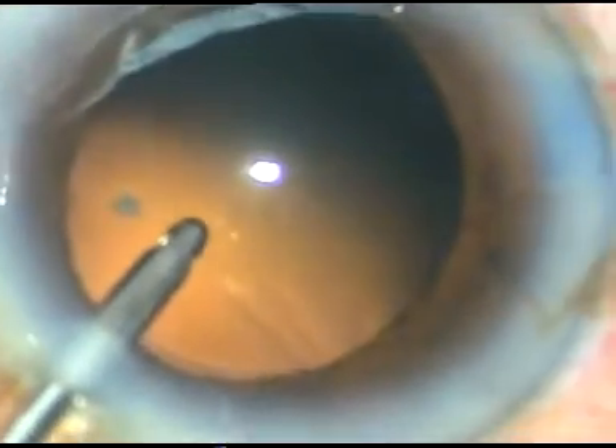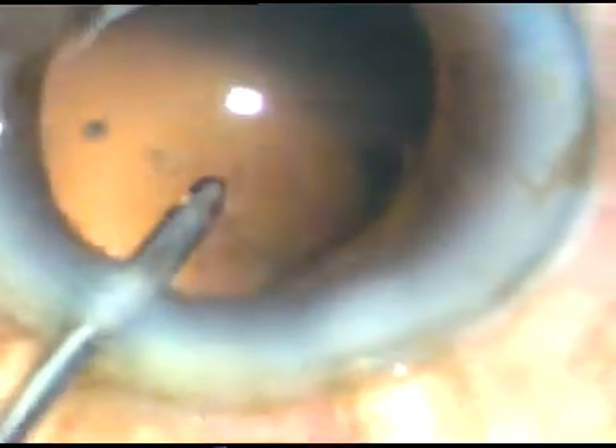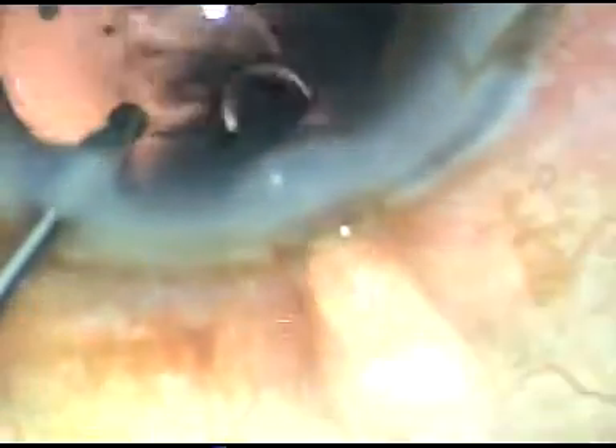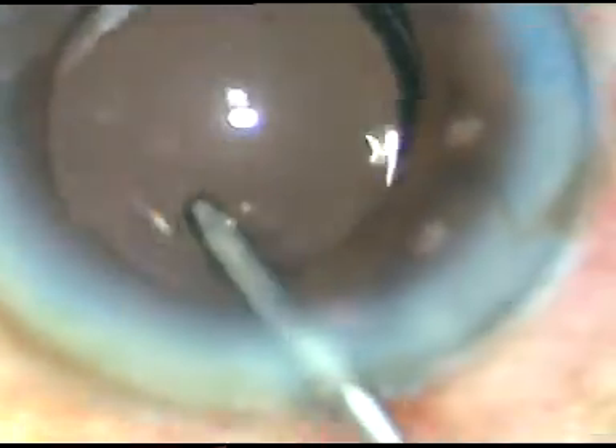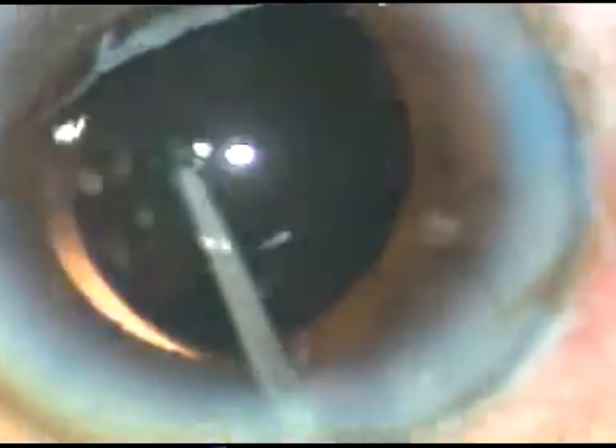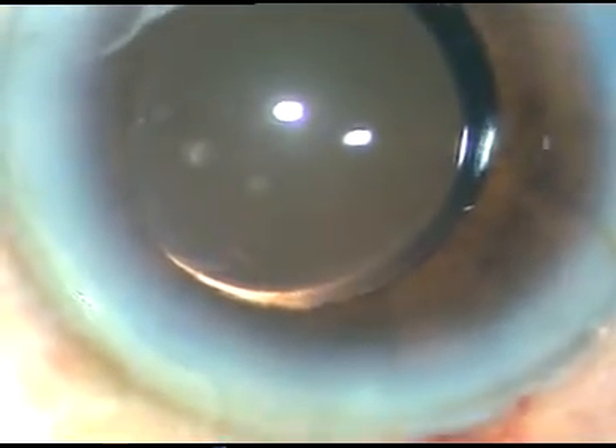I go through the sideport and irrigate, then implant a hydrophilic acrylic intraocular lens under irrigation. The leading haptic goes into the bag, and the trailing haptic — with just a nudge of the irrigating probe — also goes into the capsular bag. I then go behind the bag and irrigate to remove any viscoelastic remaining in the lumen of the cartridge by flushing it out.